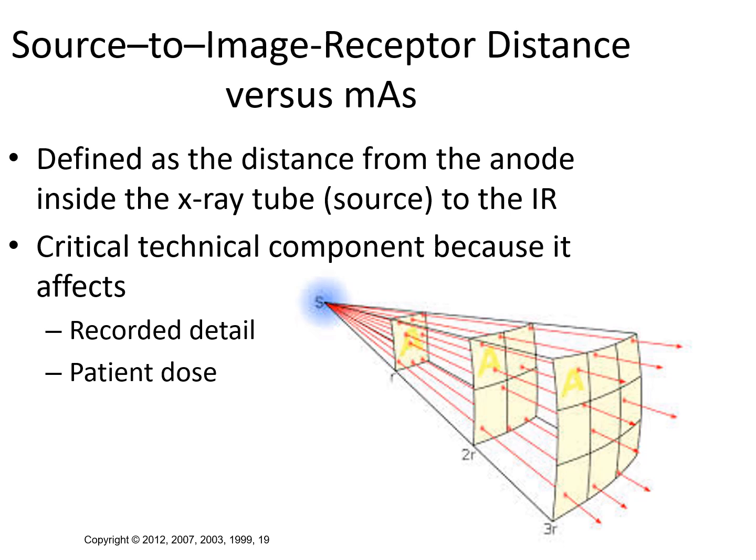And then at 3R, it is 1/9 the original intensity. So if we had 9 photons in the first area A, by the time you're 3 times the distance away, you only get 1 of those 9 photons on average in the same area A, okay? There's 9 of those areas now. So what that means is the beam thins out as it travels further away from the X-ray tube, okay?